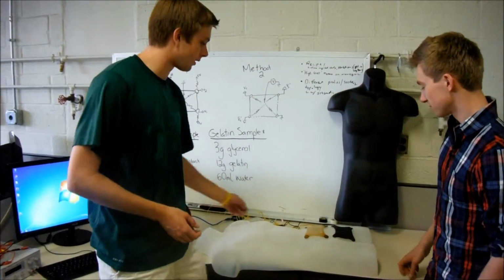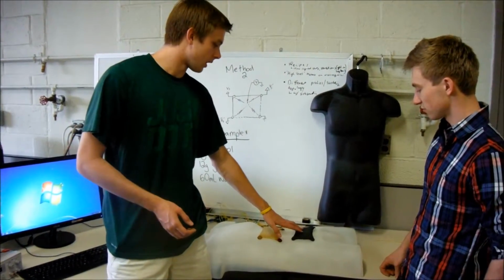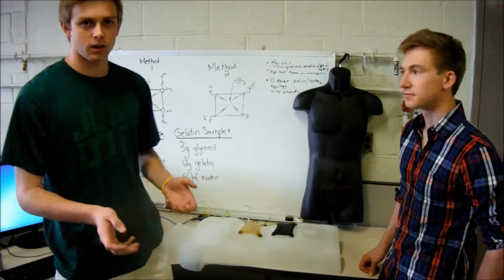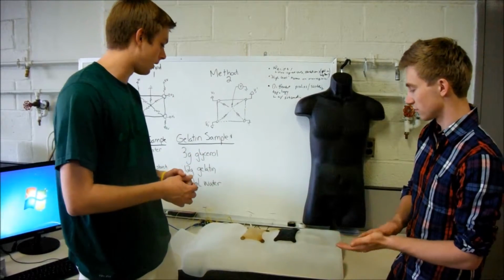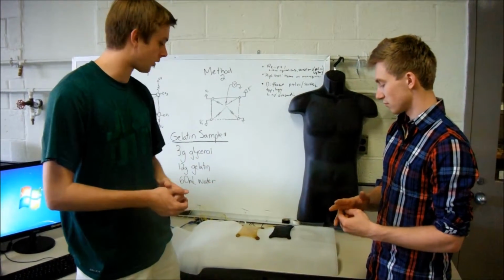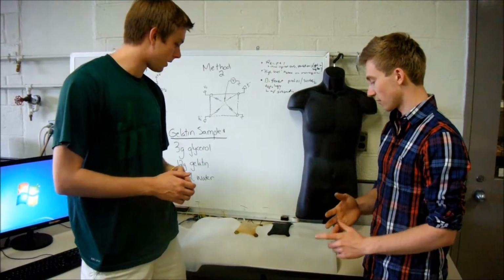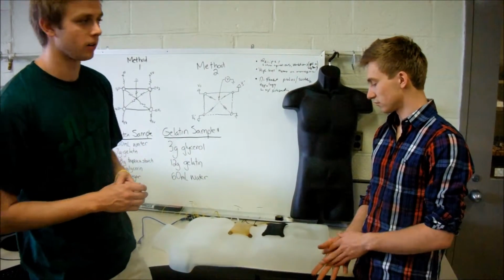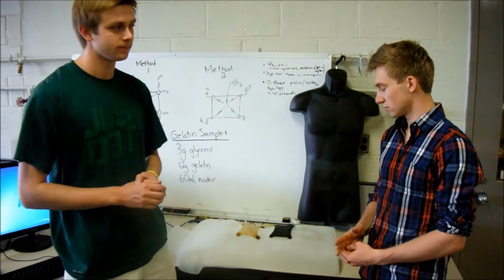And then these are 2 more usable samples that we made using the same recipe. However, this one has carbon powder in it, or graphite, to increase the conductivity, or that was our original thought. They're both the exact same original material, with the added graphite to make it black, but they both have pennies on each corner, which we think helps to increase the voltage that is supplied to the sample. And these both have worked out very well, and we are working to further finalize and perfect these models so that they are completely homogeneous as well as conductive enough to make the voltage measurements.